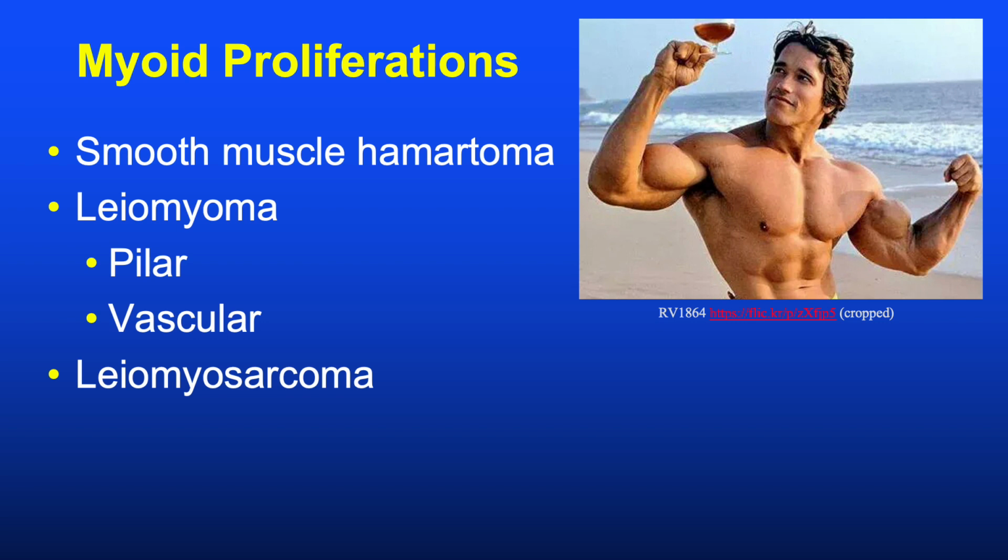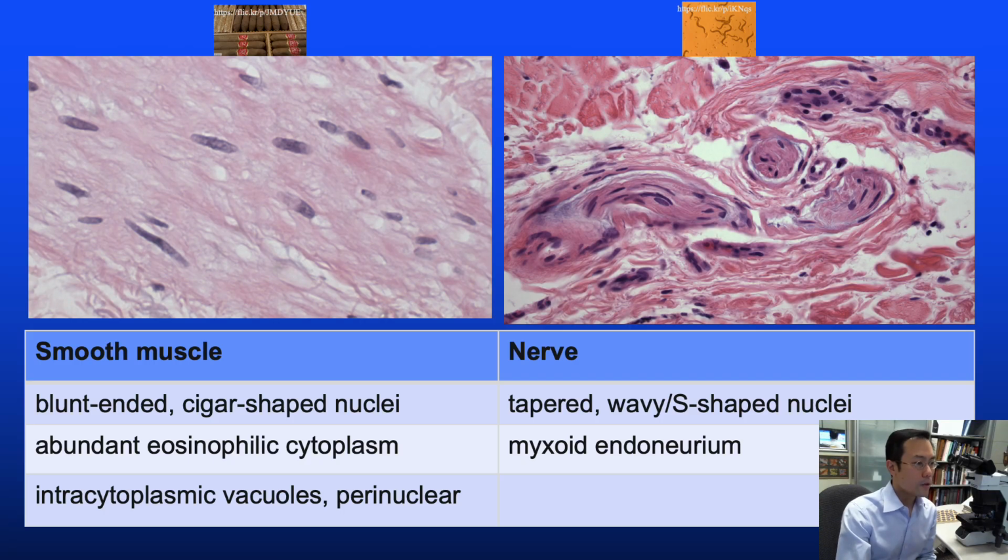And so, as we get closer to the end, I propose that we make the list of disorders even shorter. So we can have a short list, and that's partly facilitated by the fact that in the broad superficial world of dermatopathology, we can largely get away with skipping skeletal muscle and certainly cardiac muscle tumors, but we do need to deal full on with a wide spectrum of smooth muscle related tumors. And so this is front and center for the differential of spindle cell tumors.